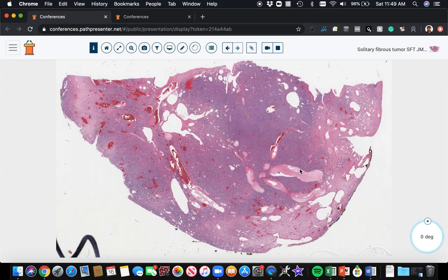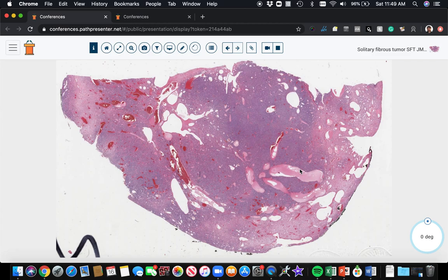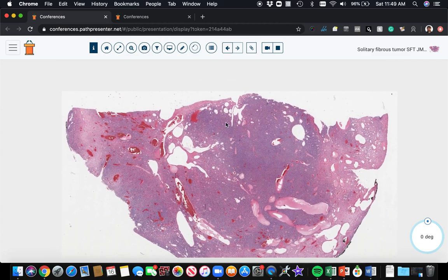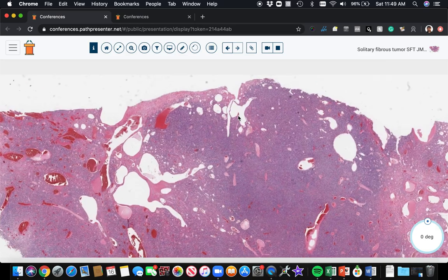So this is a very nice example of a solitary fibrous tumor. In the olden days, these were called hemangiopericytomas, and we still use the term sometimes hemangiopericytic vessels for this very unique vascular pattern that we see, but I will point out it is just a vascular pattern.